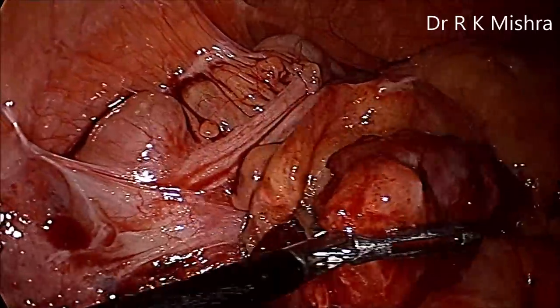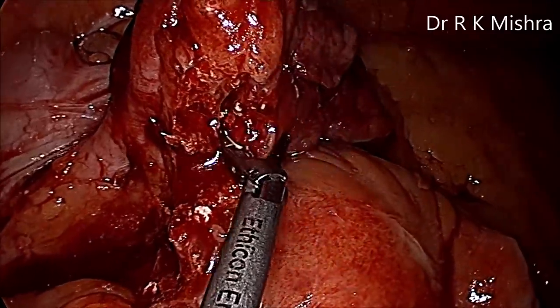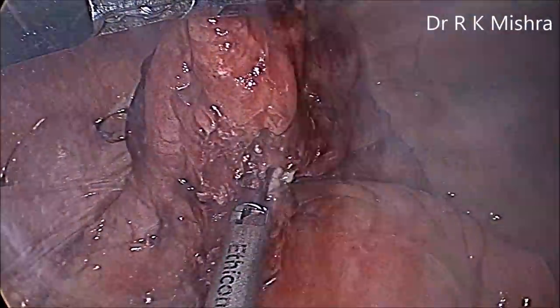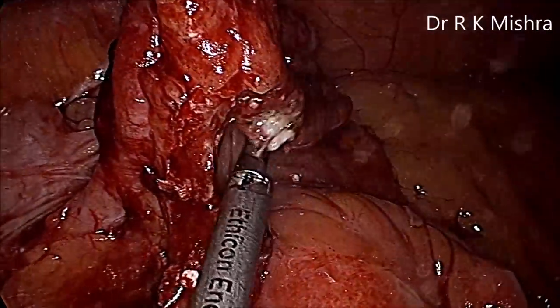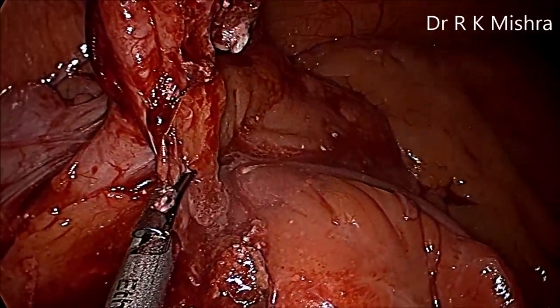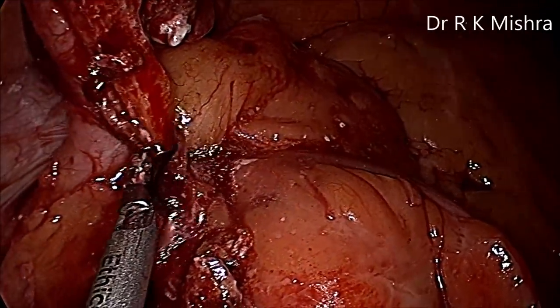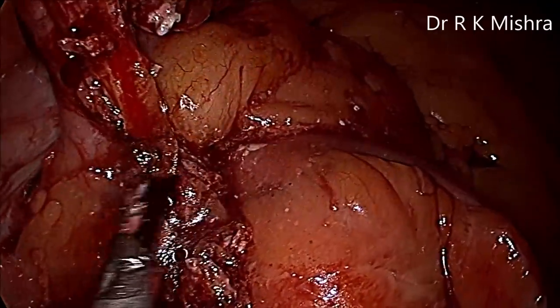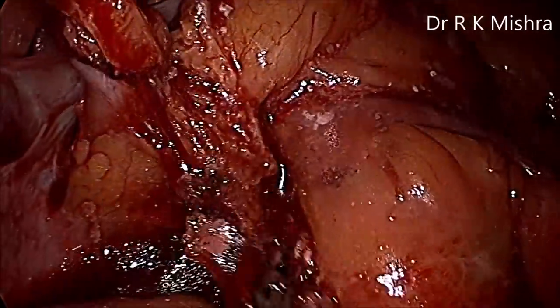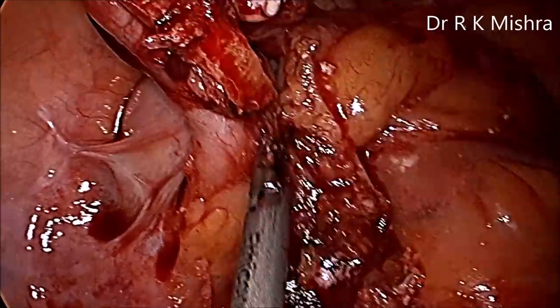Now again going to the opposite side. Again, slowly the mesoappendix will be dissected. The appendicular artery will be inside this lump, so you have to be careful. The Teflon jaw of the harmonic should always be kept towards the appendix so that the vibrations do not knock the appendix. And slowly you can separate the mesoappendix. The left hand should keep giving the anteromedial traction and the right hand separates completely. Now we have reached the base of the appendix.